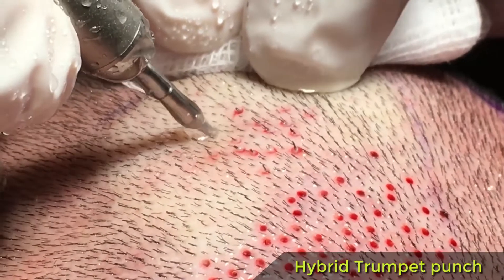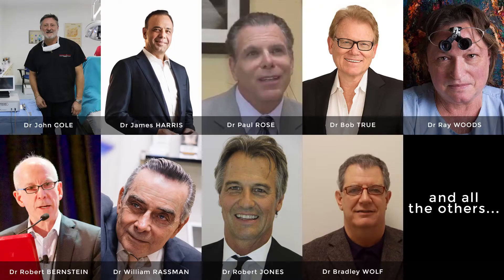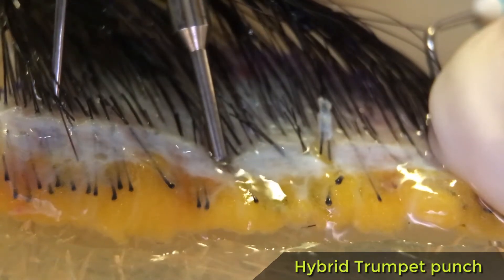Extracting follicular units with micro punches — what a wonderful idea. Many prominent surgeons have devoted their energy and intelligence to this cause. But the process is not as easy as it seems.